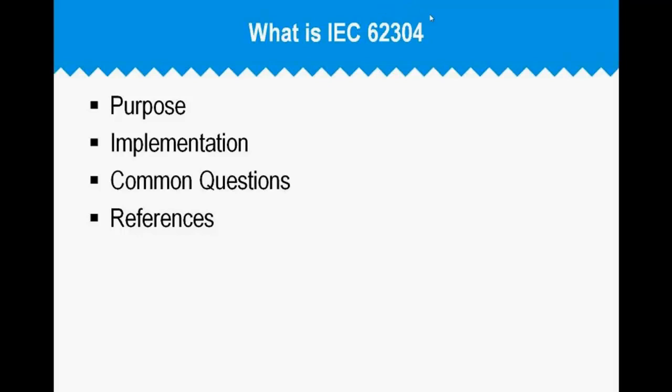I think they're generally familiar with the FDA's guidance on general principles of software validation, and they've had some background and training on how to evaluate that when they come into an organization like ours. And so to bring out the individual terminology and definitions that are provided in the 62304, those are very handy because oftentimes we're tripping over terms and definitions. We actually took many of the terms and definitions and created our own software glossary from that. So glossary and definitions is a handy thing. If all of us can be speaking the same language in these things, that gets us at least 50% of the way.